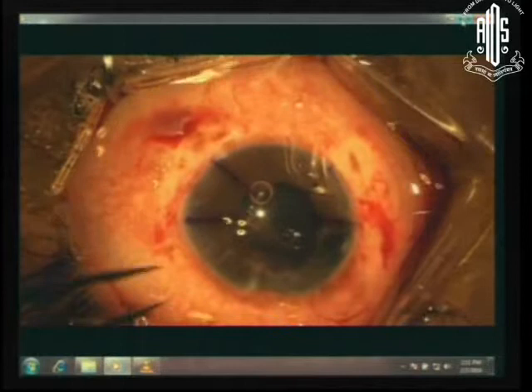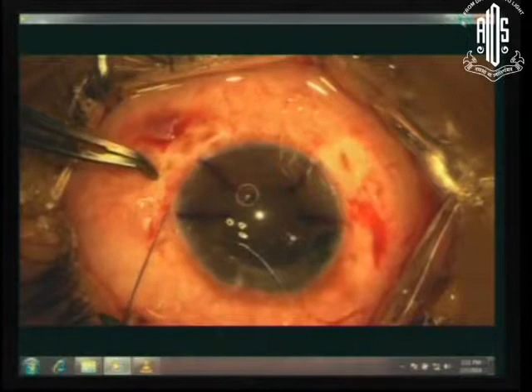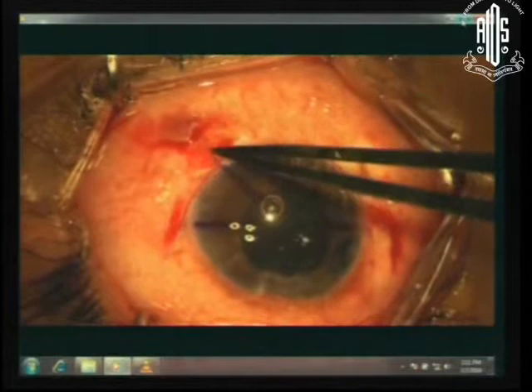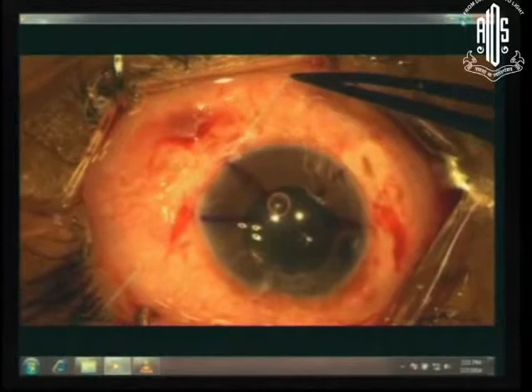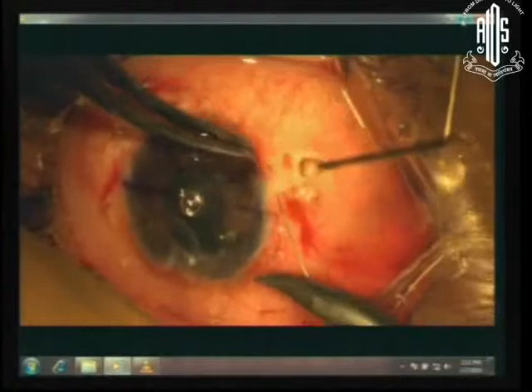Now comes the interesting part. Bury your needle in the depths of the incision, take it out and tie your suture — one end, two out, double at one side, one at one side. The suture gets buried into the groove which you have made. In a similar manner, take it to the depth of the incision and pull it out again at the other end of the incision. The whole idea is that the knot has to be buried. Once the knot is buried you no longer have anything more to bother about.